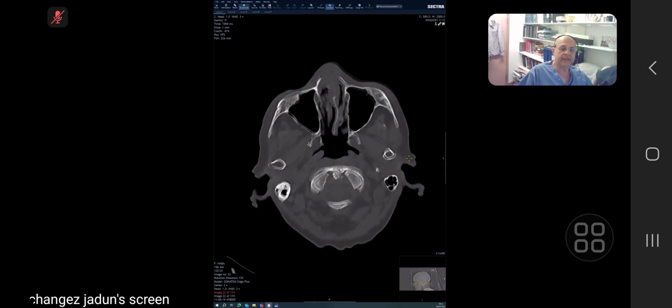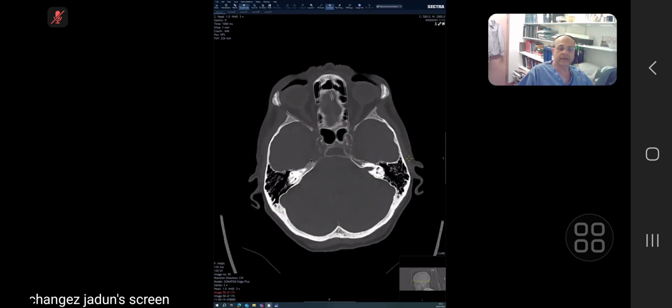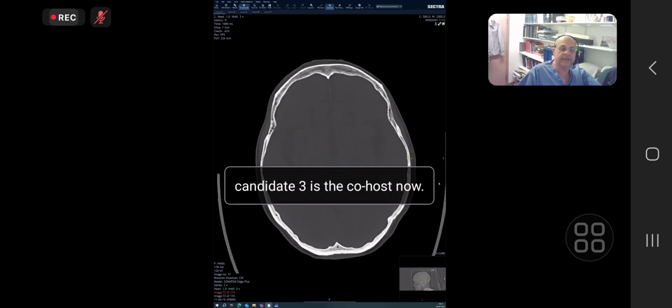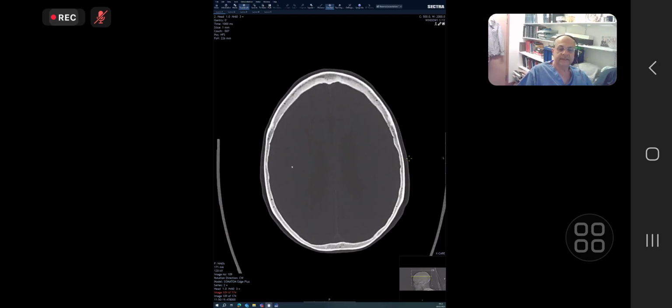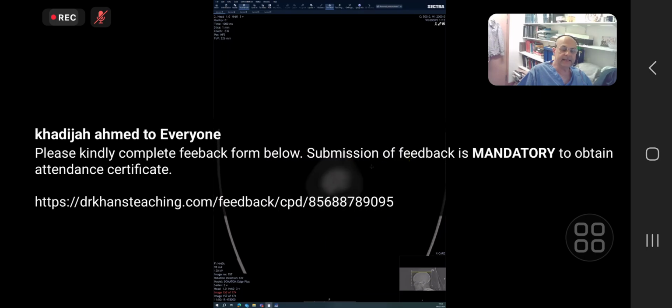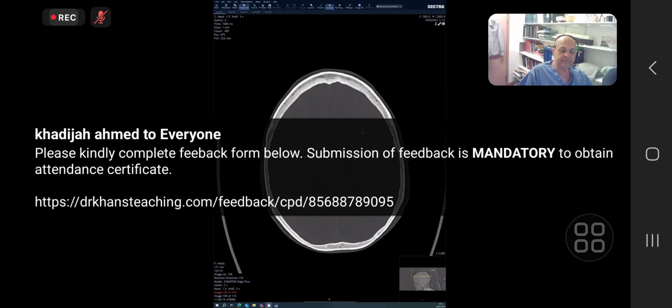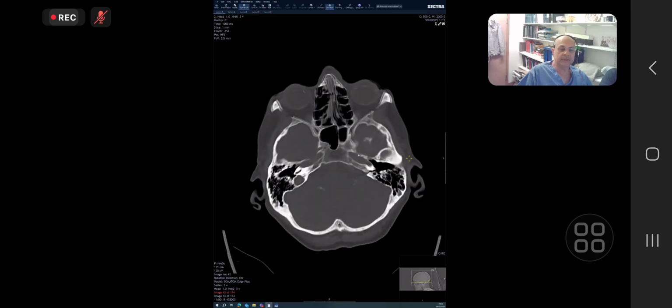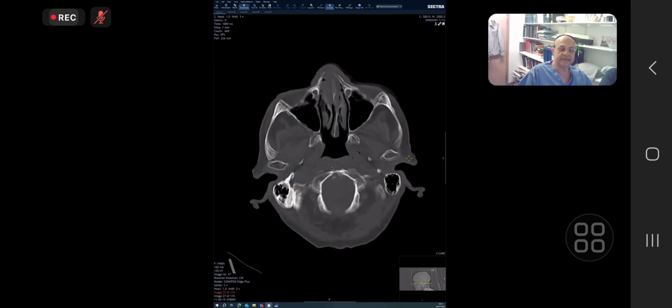They look okay. Zygomatic arches are okay. I'm looking at the squamous temporal bone. So you are coming up on the middle part of the brain. Then I say I'm going down on the occipital part of the calvarium. There is nothing in the occipital bone, nothing in the petrous temporal bone, etc.